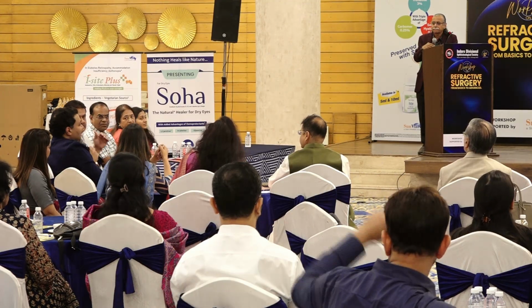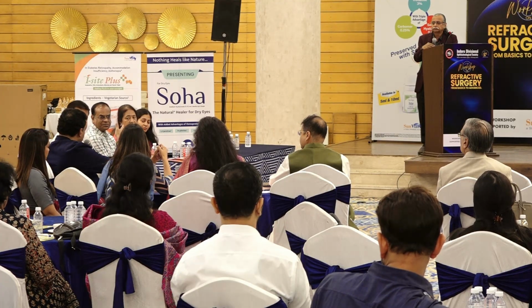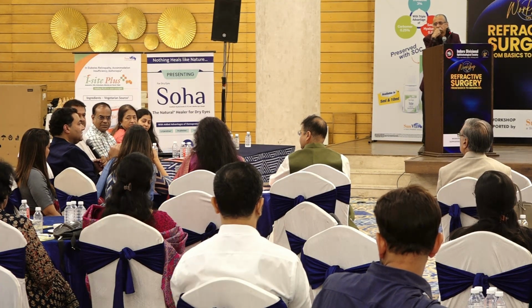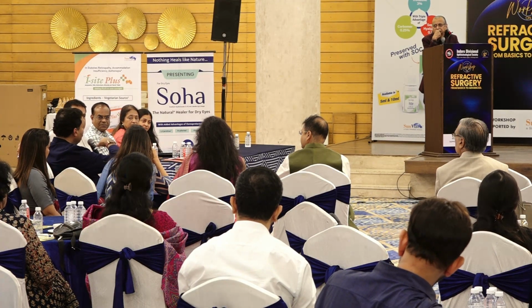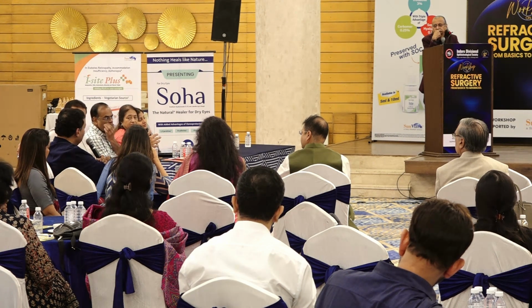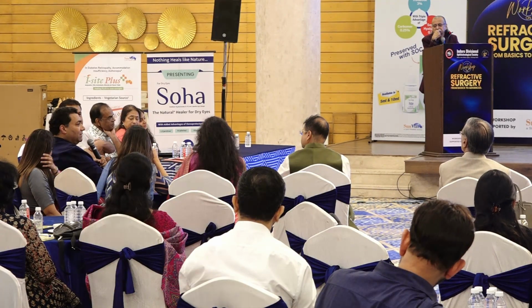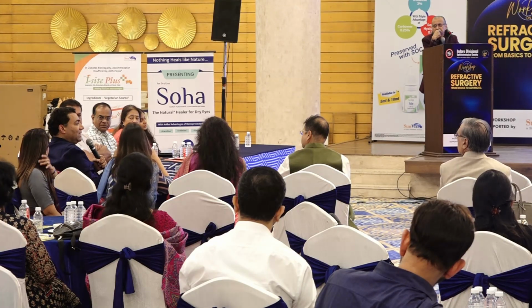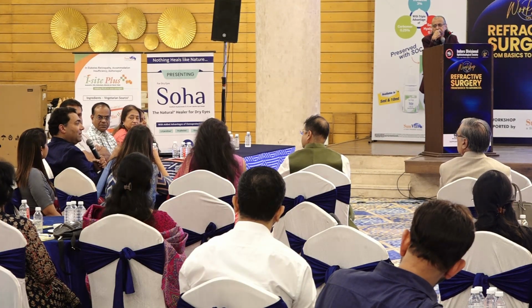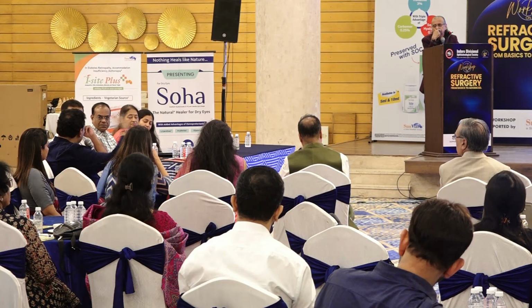And one thing which is very useful in this type of procedure, and also SILK and these procedures, is that you are maintaining the asphericity of the cornea at such a good level that even if you are treating -6 with a wavefront optimized treatment versus a -6 with this, there is at least 28 to 35% preservation of your own spherical aberration in your cornea and preserving your Q value compared to a regular treatment.